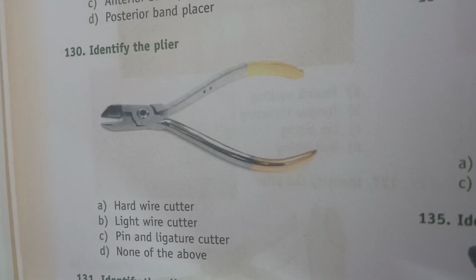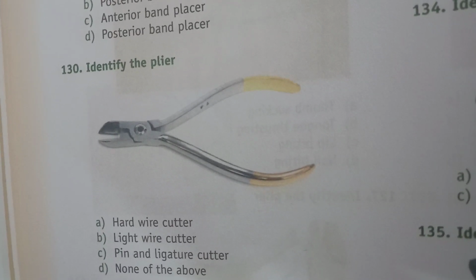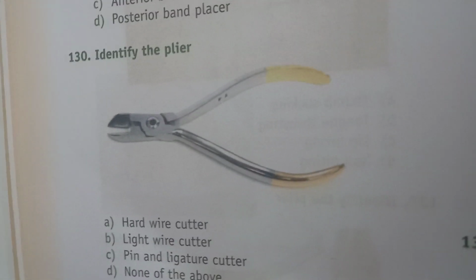Next, identify the plier. I think it's the easiest question. It is hard wire cutter.